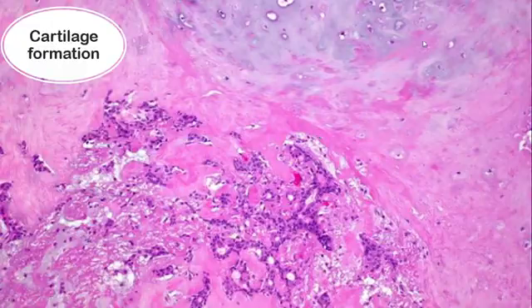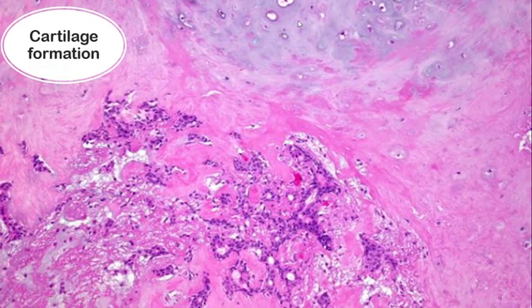Even mature hyaline cartilage can be seen, lacunae with the surrounding cartilaginous stroma and hyalinized areas. In addition to these, islets and nests of neoplastic epithelial and myoepithelial cells. This is the typical picture of pleomorphic adenoma. Pleomorphic: epithelial, stromal, myoepithelial, cartilage, myxoid stroma, and so on.